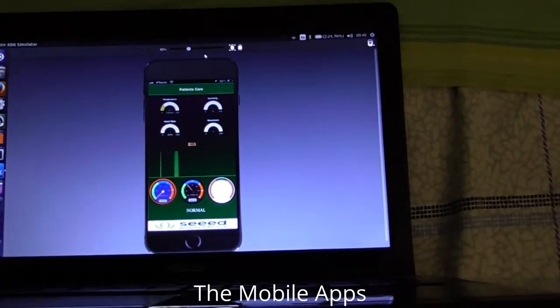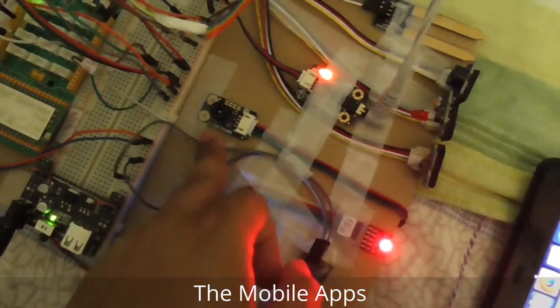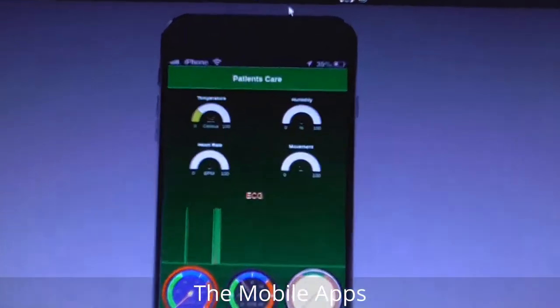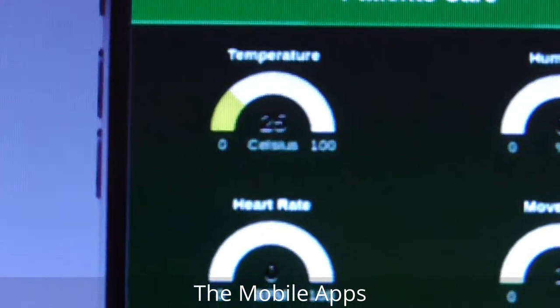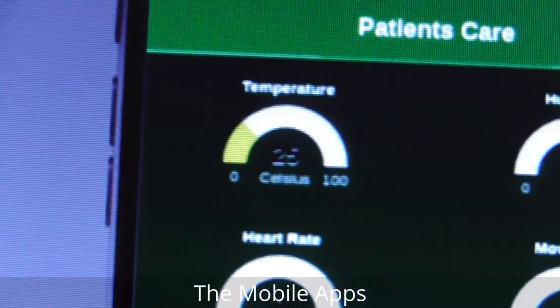Let's check the temperature. This is the temperature sensor. The temperature is now around 25 degrees Celsius.